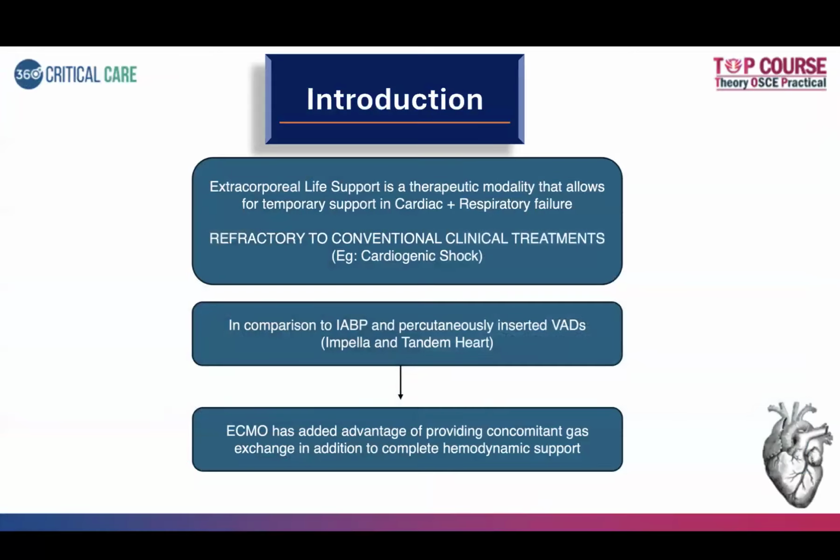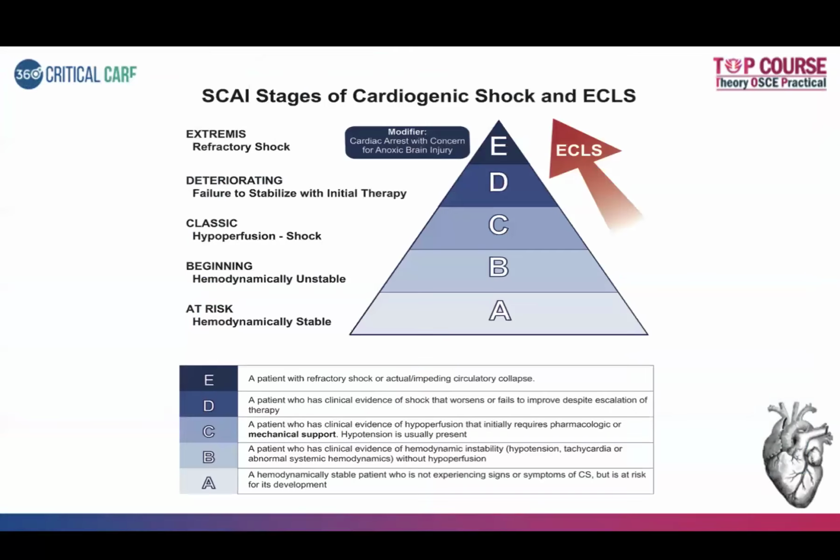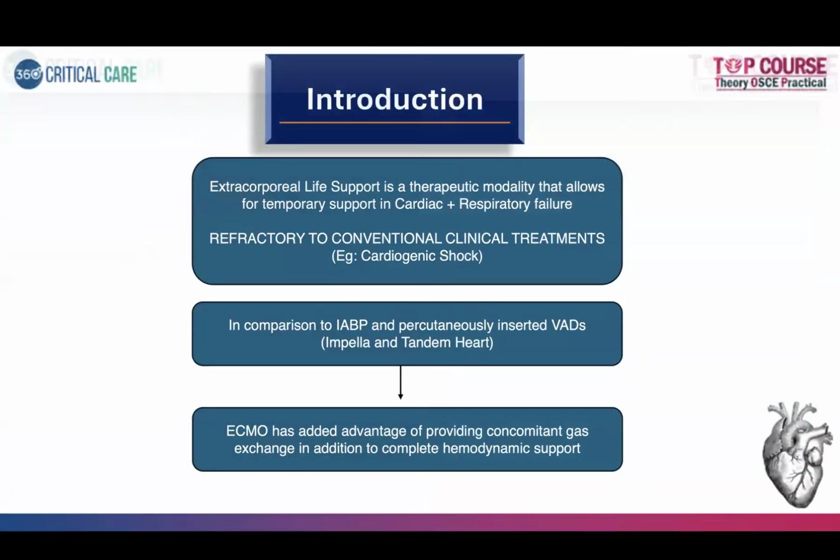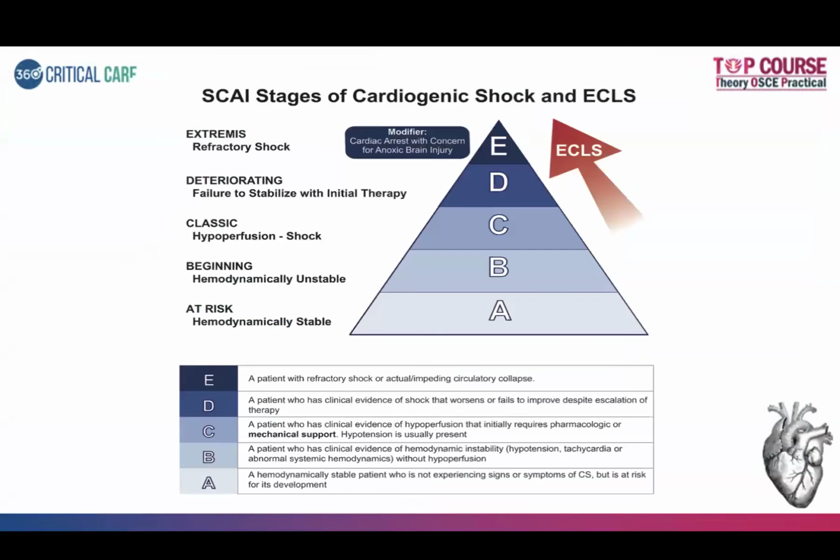So coming to introduction, ECMO is a form of extracorporeal life support that allows for temporary support in cardiac and respiratory failure. So it is a modality that can be used in both cardiac and respiratory failure. That is an added advantage over Tandem Heart and Impella.